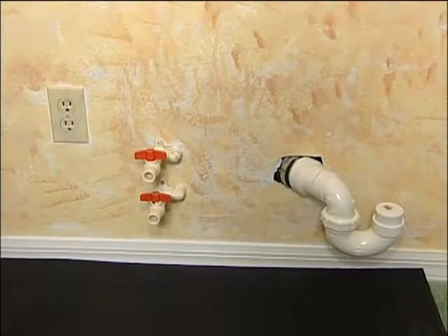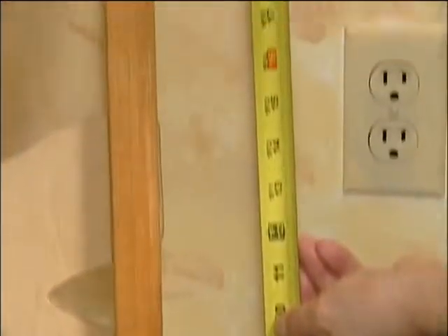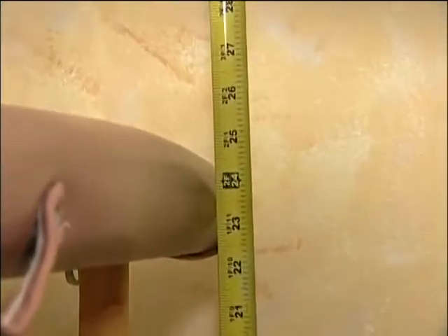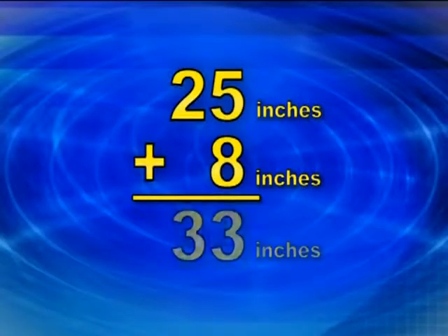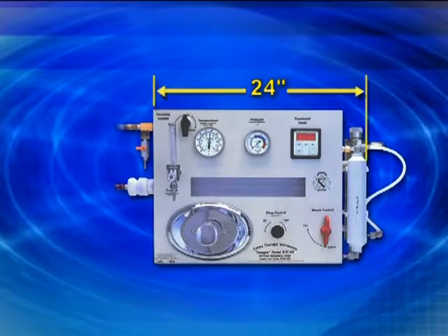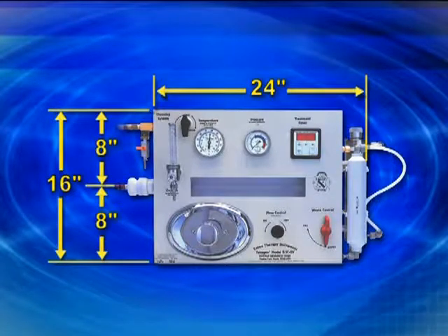With the rough plumbing installed meeting the specifications of Figure 3, you're now ready to mount your instrument on the wall. Measure your treatment table from floor to top, then add 8 inches to this number — this total will equal the height where the top of your instrument should be installed. Your instrument's dimensions are 24 inches wide and 16 inches tall. The waist connection line is in the middle of the instrument, 8 inches down from the top and 8 inches up from the bottom.